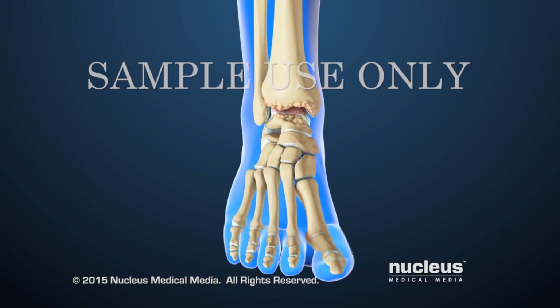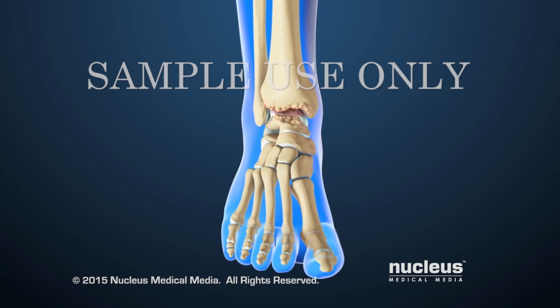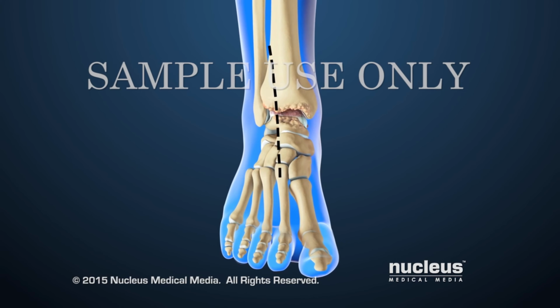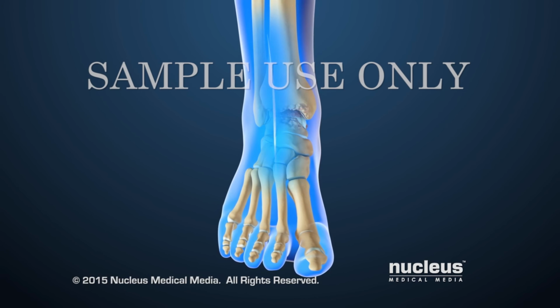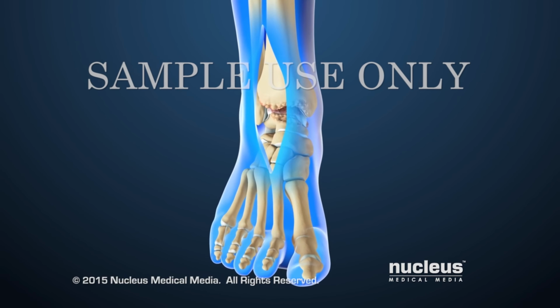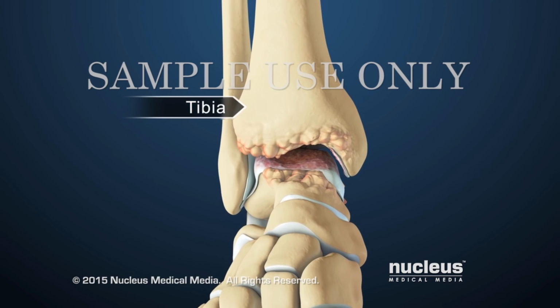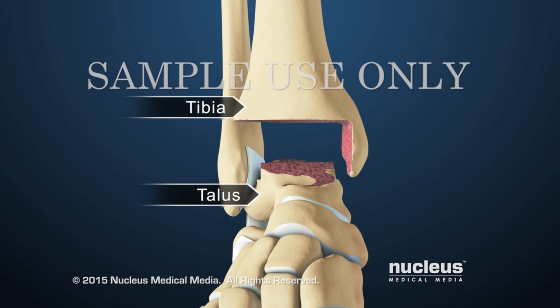A surgical procedure called total ankle replacement is done to replace a severely damaged ankle joint. The surgeon will make an incision on the front of the damaged ankle to reveal the ankle joint. Next, the ends of the tibia and talus will be removed.